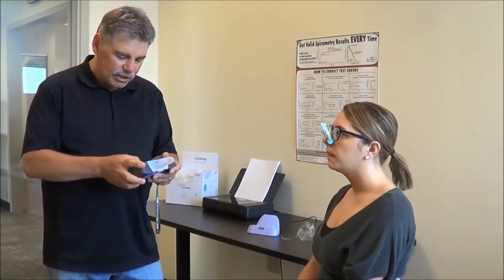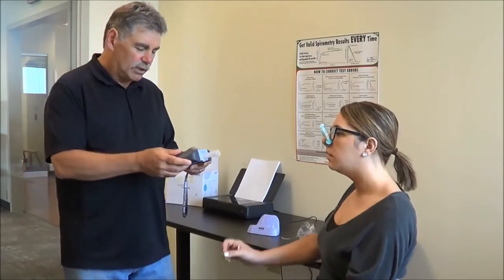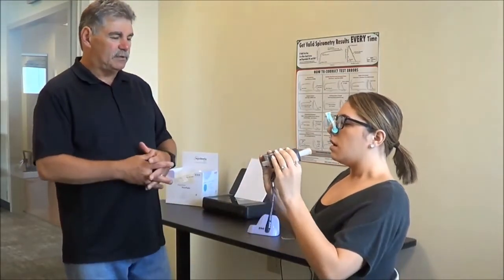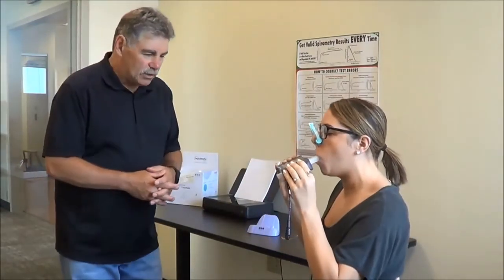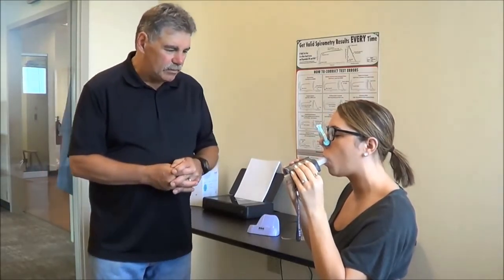So I'm going to hit add trial, and we're ready to go with the third blast. Whenever you're ready, fill it up, fill. Blast! Go. Push. Keep going. Keep pushing.